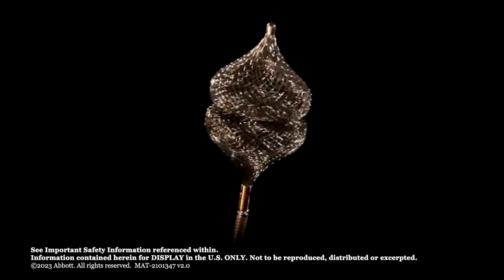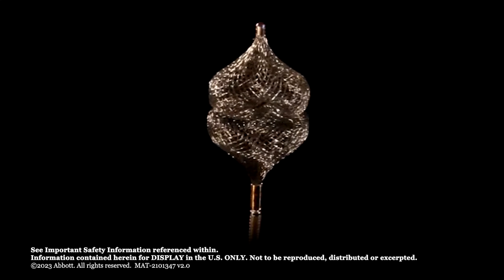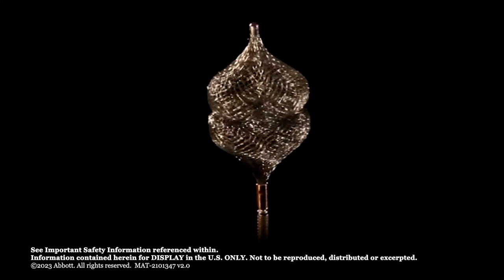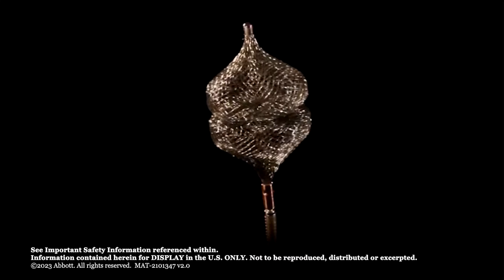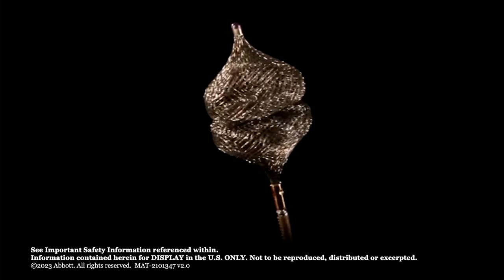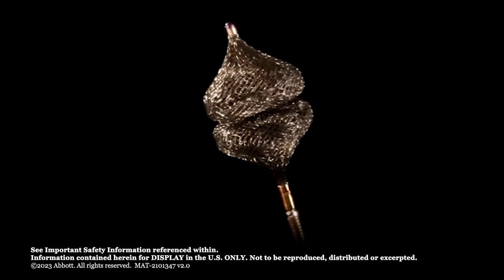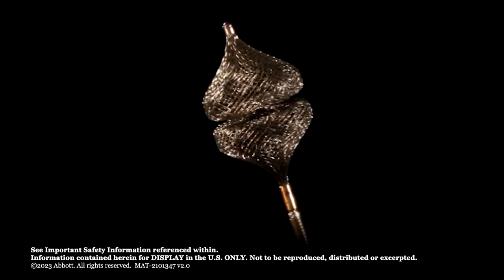The Amplatzer Vascular Plug 4 is an addition to the Amplatzer Vascular Plug family, providing single device solutions for optimal peripheral embolization. This low-profile device is designed for arterial and venous embolization in the peripheral vasculature and is delivered through an 038 diagnostic catheter.